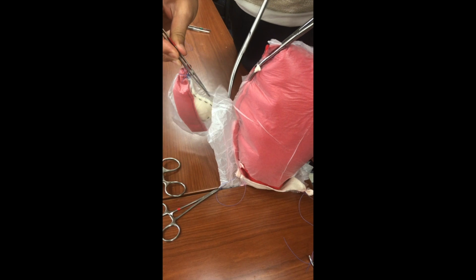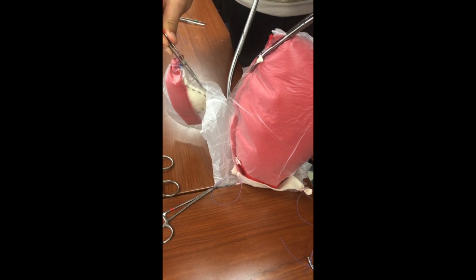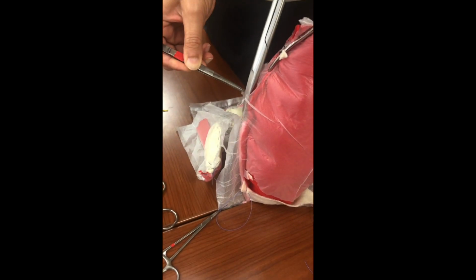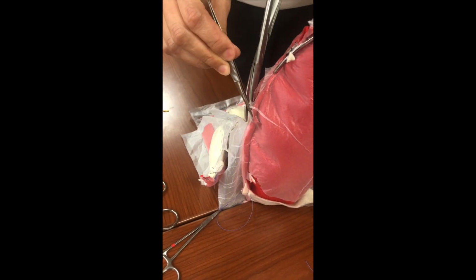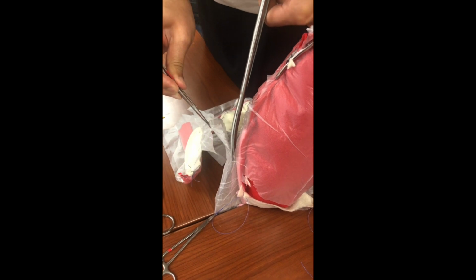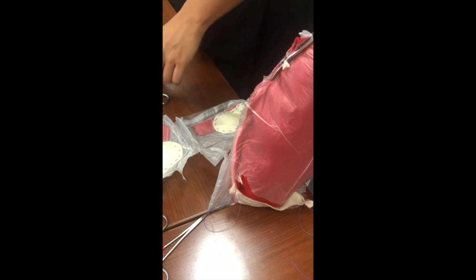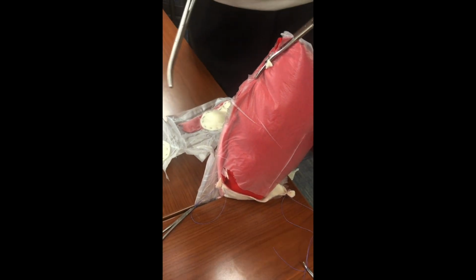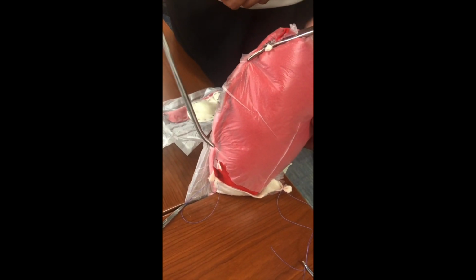Once you've divided the utero-ovarian ligament and fallopian tube, you can proceed to dissect open the anterior leaf and posterior leaf of the broad ligament. Palpate and identify the uterine artery. Then start skeletonizing the uterine artery. Use a Heaney clamp to grasp the uterine artery, as shown here.